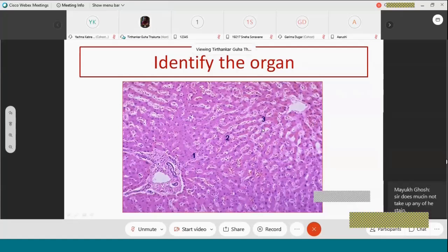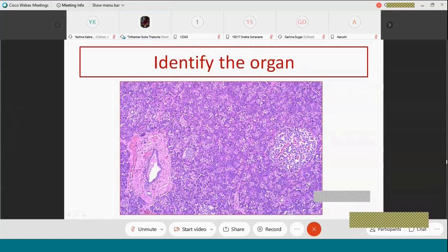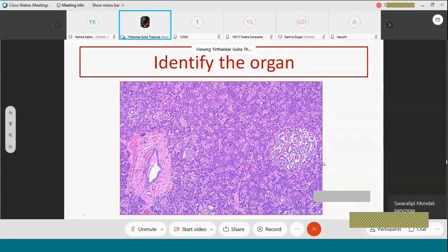Look into this organ. It's an organ densely filled with cells. There is also a duct-like structure, so it may be an exocrine gland, but there is a unique collection of cells by the side, which looks totally different, and is filled with blood vessels.